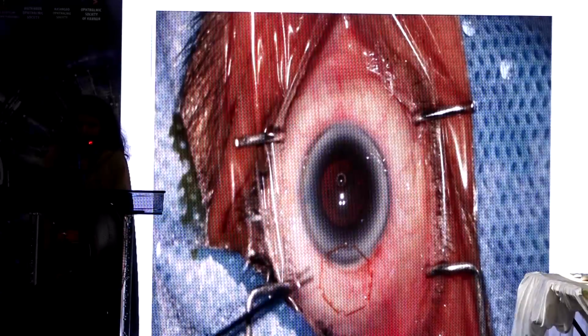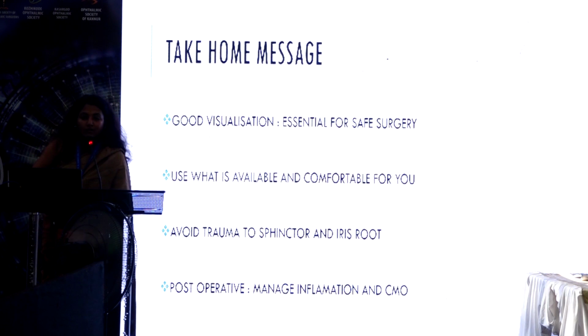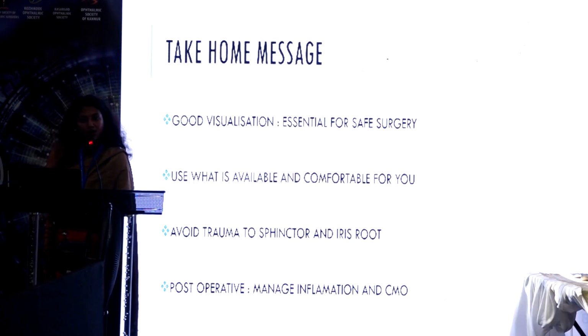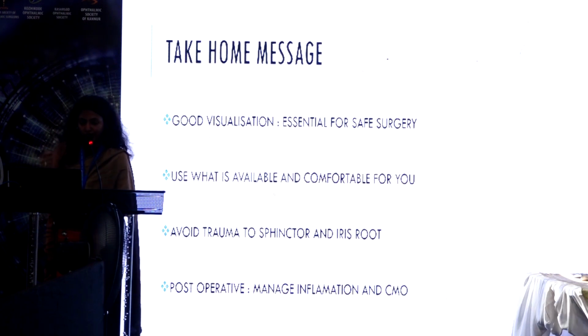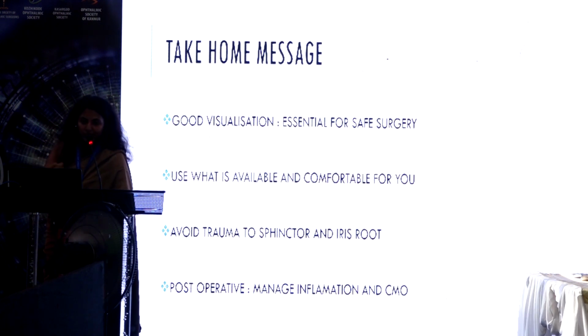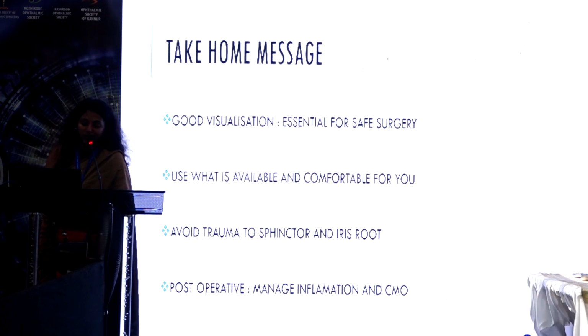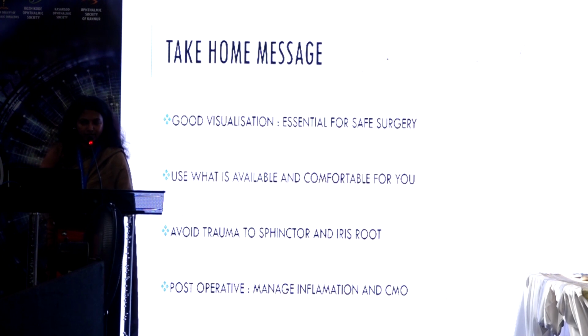And just going to the next thing, the take-home message I would like to say is, good visualization again is essential for safe surgery. Use what is available and what you are comfortable with. Avoid trauma to the sphincter and the iris root, because you may be enthusiastic and you may pull, so that will cause damage and iridodialysis. And post-operatively, you may need to manage the inflammation and cystoid macular edema, which is seen slightly more in these cases, which may require devices to be used.